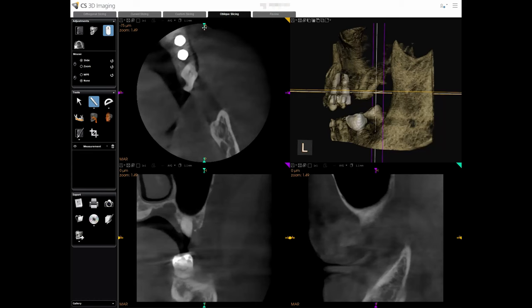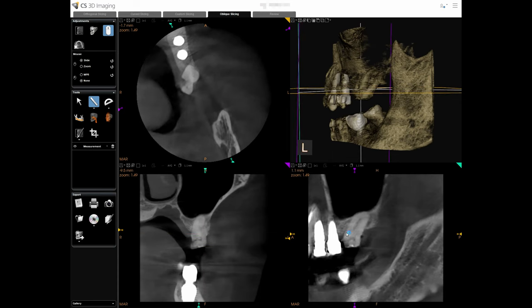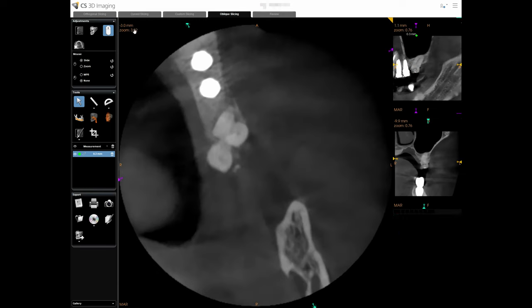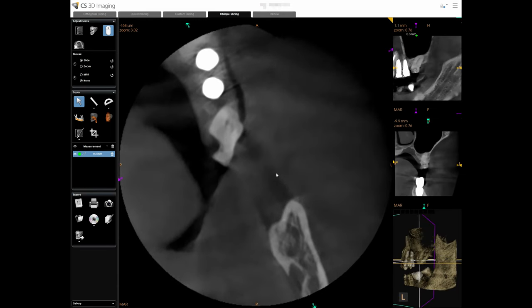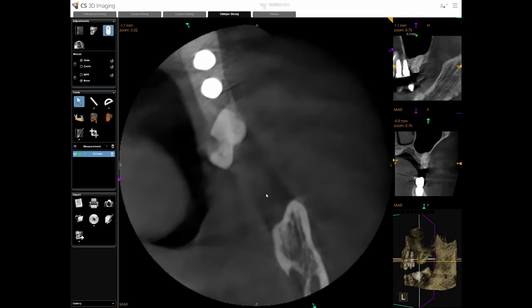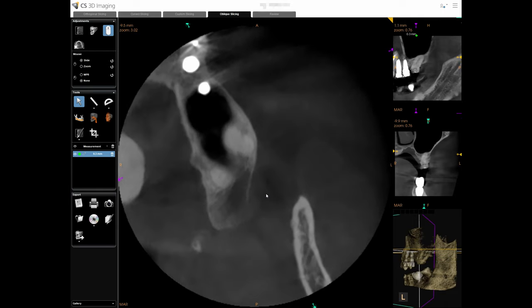You're saying, why is this so funky? Well, let's take a look at that cone beam. I'm going to show how I line it up on the cone beam — I use the CareStream software. Pro tip: if you middle click, you can actually center the cursors on wherever that middle click is. So you will see there is this tooth is rotated about 45 degrees. There's a really deep decay on the palatal — strange rotation for sure.